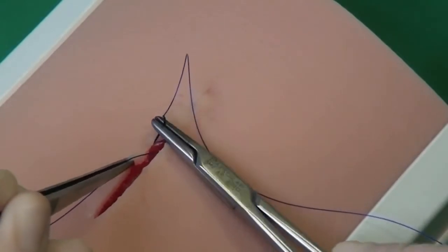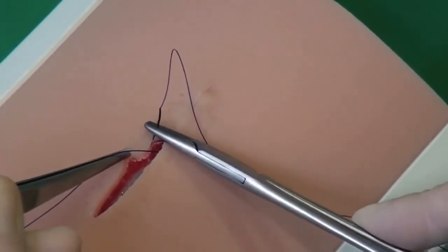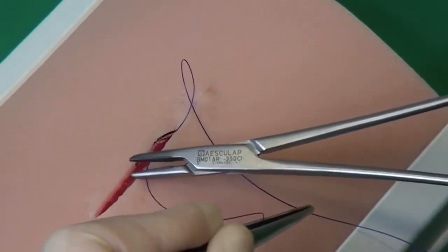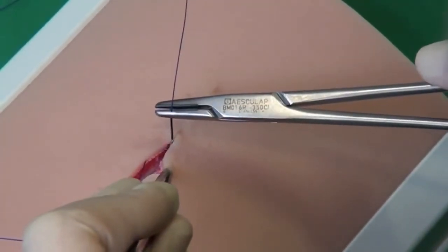The intracutaneous suture is placed over the subcutaneous suture and closes the superficial layer of skin. This is used, for example, on wild animals so that the sutures don't have to be removed at a later time.